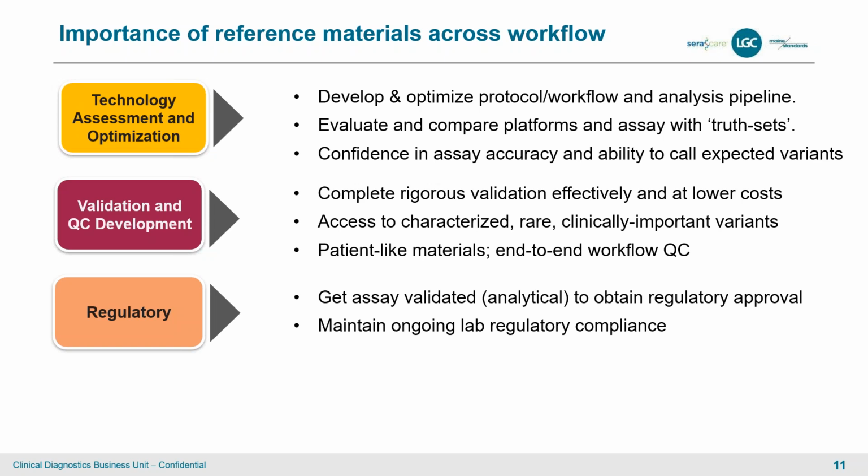So they're going to be doing audits once a year, once every couple of years to make sure you're doing well. And it's important for you to know things are working well. Not only was it working well on the day you launched the assay, but is it working well 6 months down the road, right? When you change instruments, change operators, and so forth.